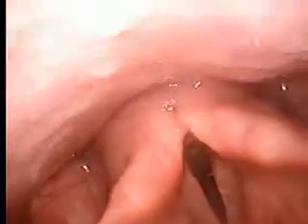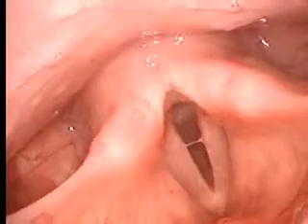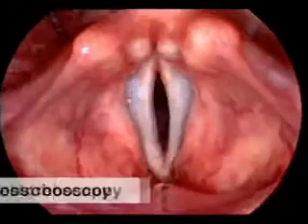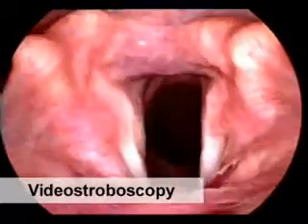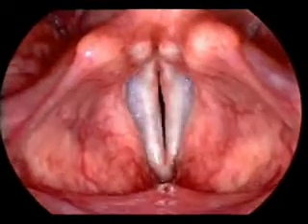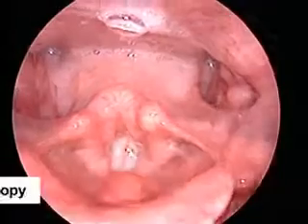In the normal patient, the vocal cords will adduct in the middle and come into contact along the entire length, allowing for a precise assessment. During human speech, a vibratory wave is formed as vocal cords produce sounds. Stroboscopic illumination of the larynx can thus reveal subtle alterations of vocal fold vibration.